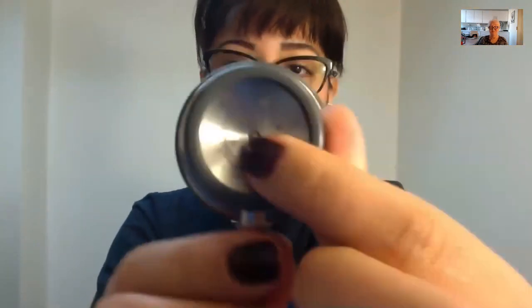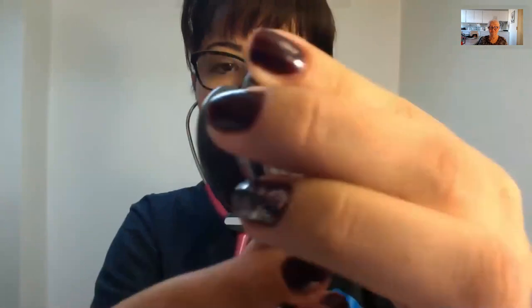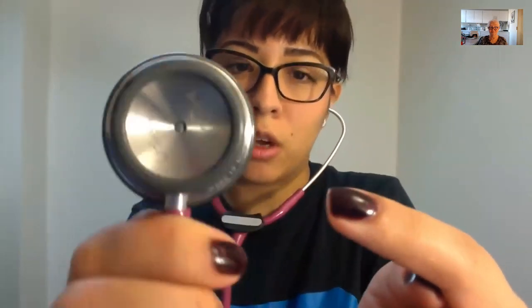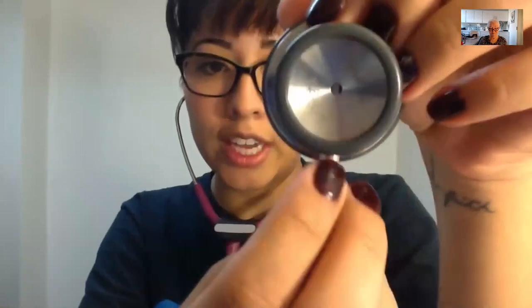Okay, this is a closed bell here. And you might want to do it really gently, because if your bell is closed and you tap here, it's very sensitive and you can hear it very well too. So when it comes to taking someone's blood pressure, you will be able to hear better. So make sure that your bell is always closed when you take the blood pressure.